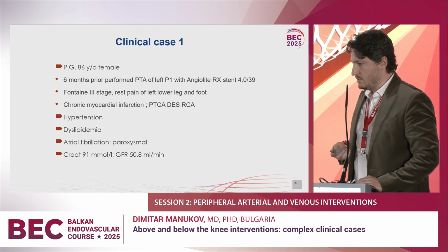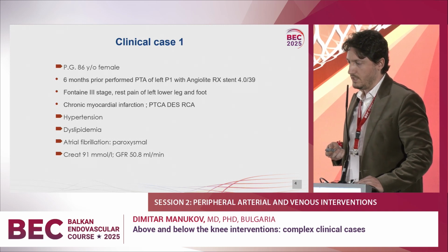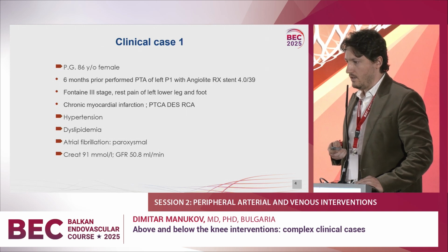Quickly to the cases. 86 years old female. 6 months prior, she had a PTA of the left P1 with an Angiolite stent. Persisting rest pain of the left leg.